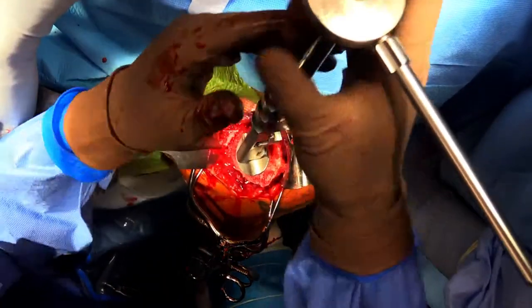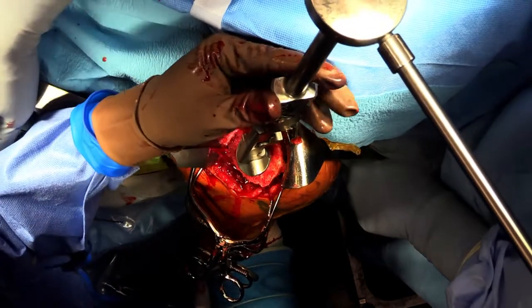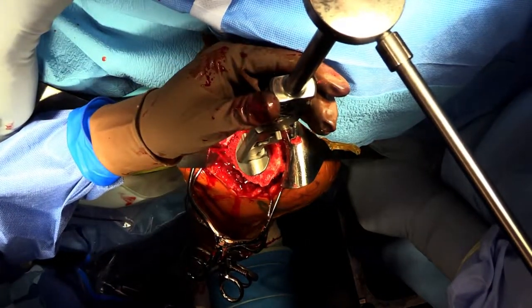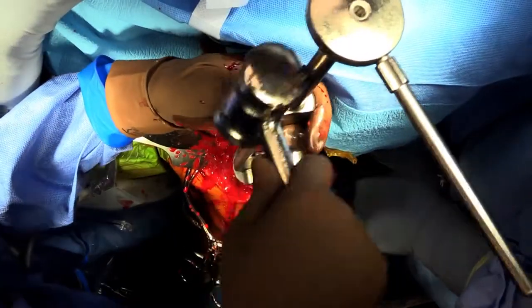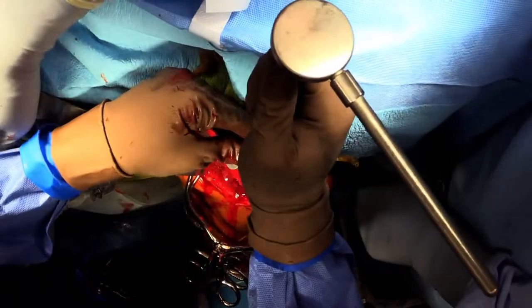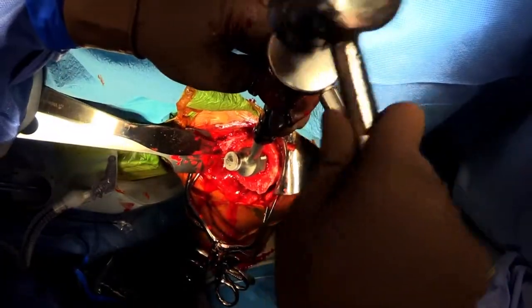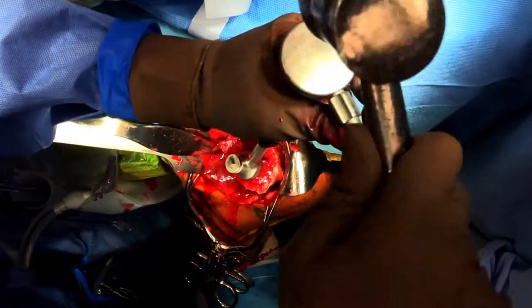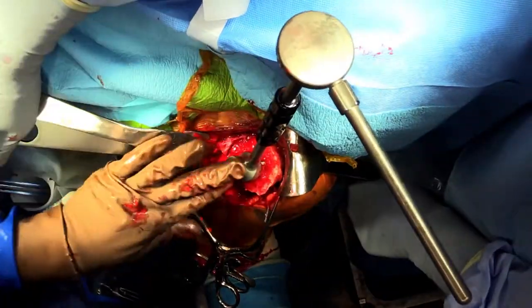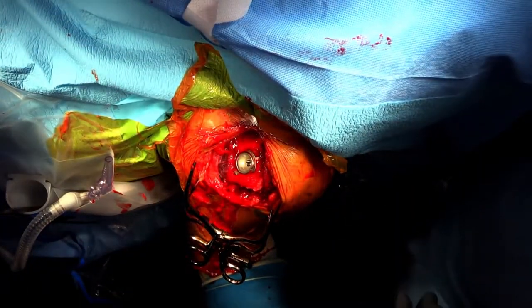Broach the corresponding size to the reamer using the version guide in line with the forearm. This will give you 20 degrees of retroversion. For the reverse primary, we trialed the stem to be sure that the correct tension is achieved. Now remove the retractors and proceed to the glenoid.